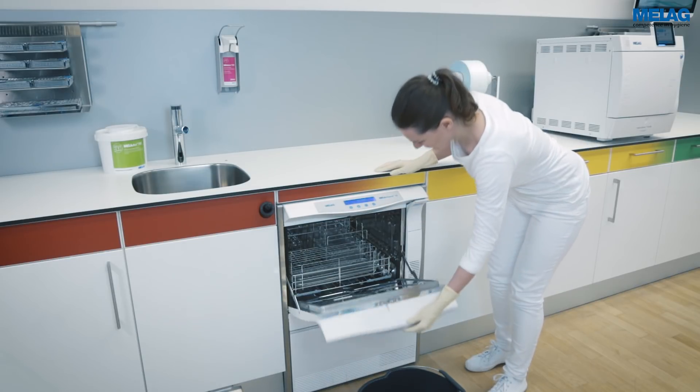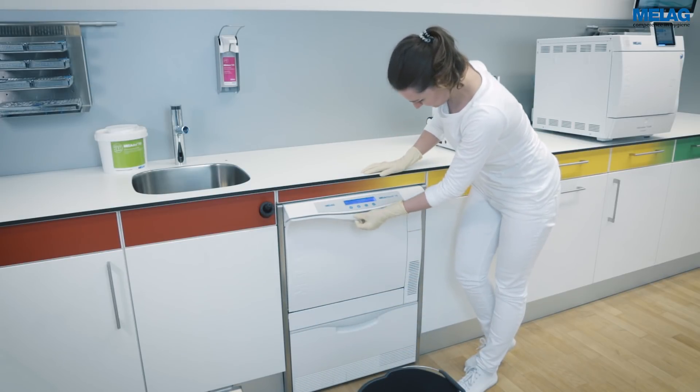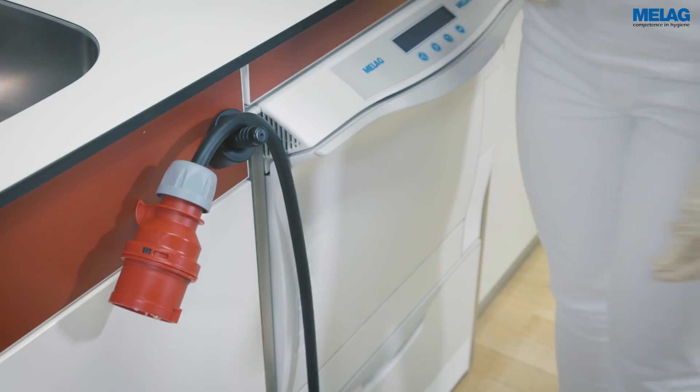Check that the washing chamber is dry and then switch off the device at the power switch. Disconnect the plug from the socket and close the water inflow.